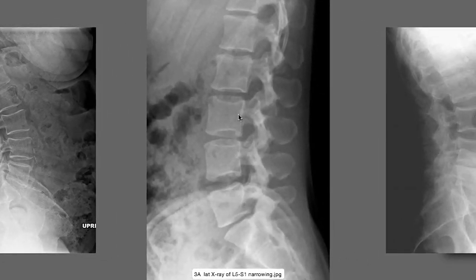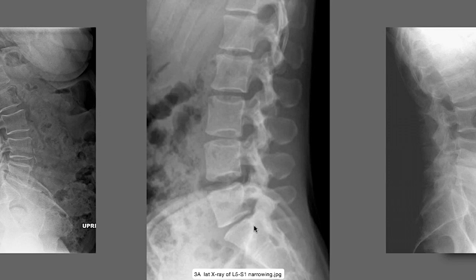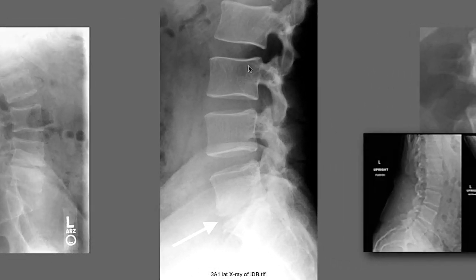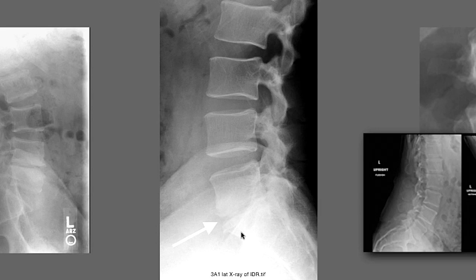On the lateral, we can see cascadingly larger disc heights as we go down until we get to L5-S1, which is quite narrowed. This is not isolated disc resorption, but this is significant degenerative disc disease. Another x-ray shows the cascade getting larger as you descend to L4-5, and then L5-S1 where the disc is very narrowed, with sclerosis of the end plates and intervertebral areas indicating isolated disc resorption.